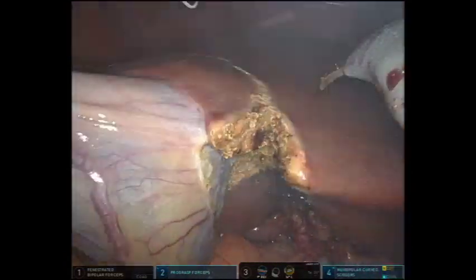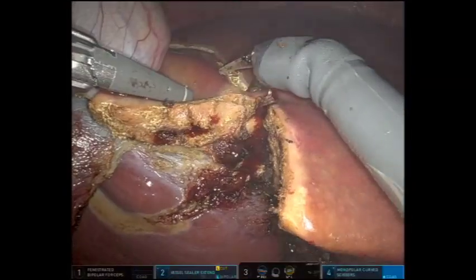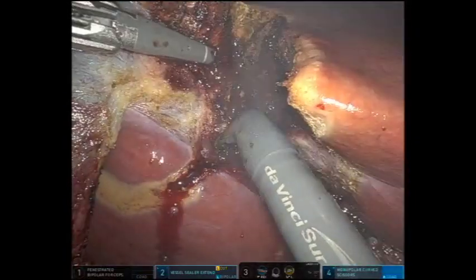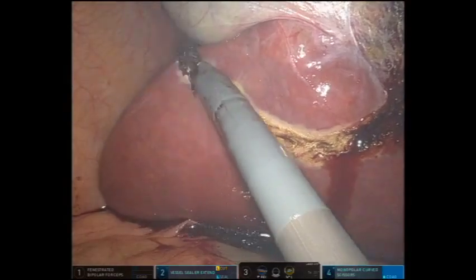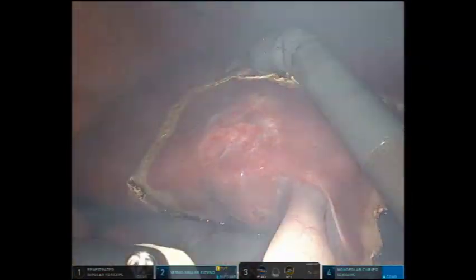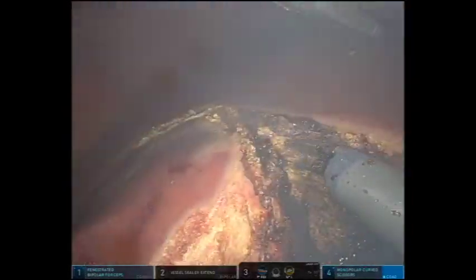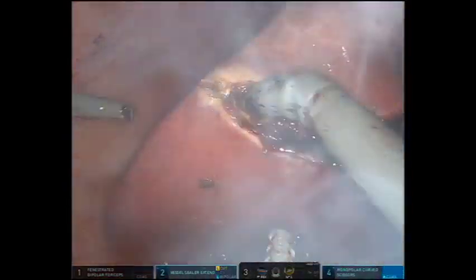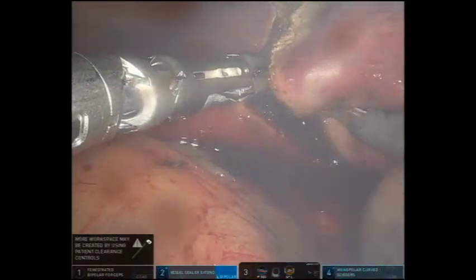The segment 5 resection was then begun using the robotic scissor. As small vessels were encountered, they were cauterized using the scissor. The dissection was continued perpendicular to the margins created using the ultrasound probe, with the scissor placed into the liver at 90-degree angles to ensure the margin remains clear.